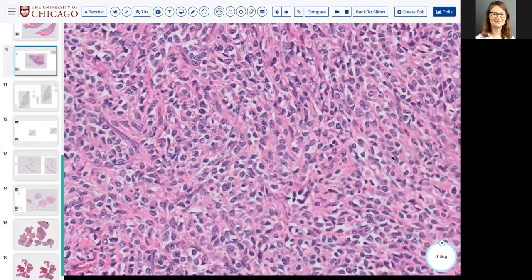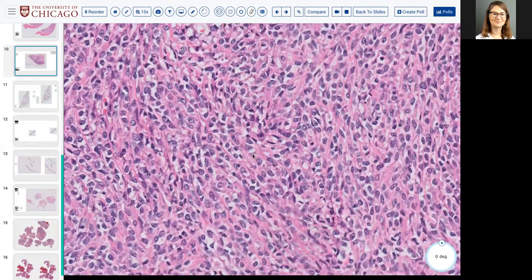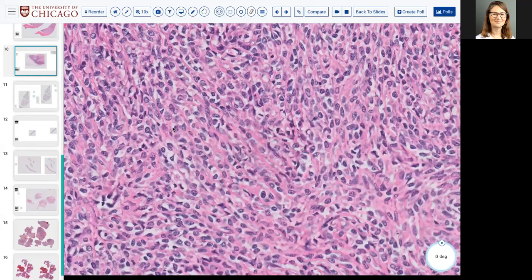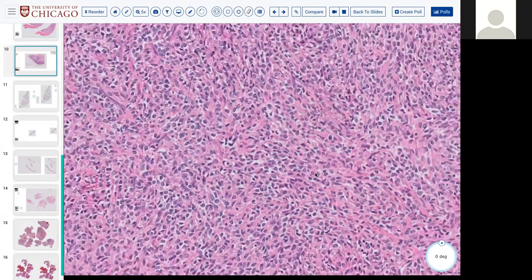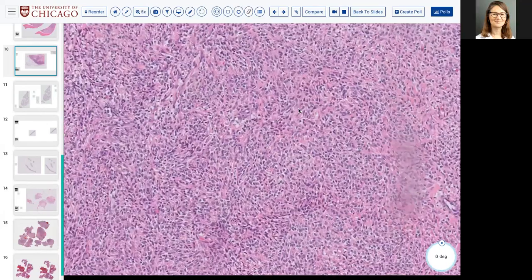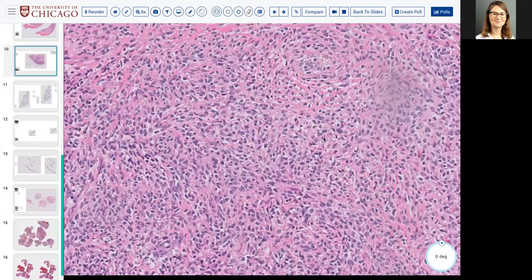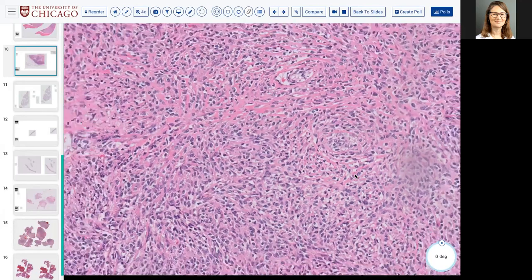Maybe not quite as pleomorphic, or maybe not quite as mitotically active as the prior, but what do you see here in this pattern? It's almost like vaguely alveolar, or, yeah, maybe cords is a better word. Cords sort of separated by these delicate, very pink structures. And you might remember the cords of the epithelioid hemangioendothelioma and consider that looked like lobular. Some might also look at this and consider, wow, there's these cells and cords that almost could look like lobular breast cancer.